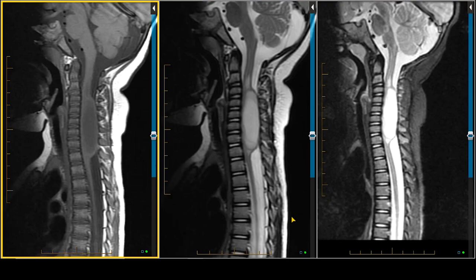Most of the time when we're considering masses in the spinal cord, we're in a differential diagnosis between astrocytoma and ependymoma. Here we have a patient who has a large mass in the cervical spine, and we see that the cord is expanded with diminution in the width of the CSF space at the borders with the mass. This lesion is dark on T1, bright on T2, as well as bright on the STIR image, which is typically what we see also with ependymomas.